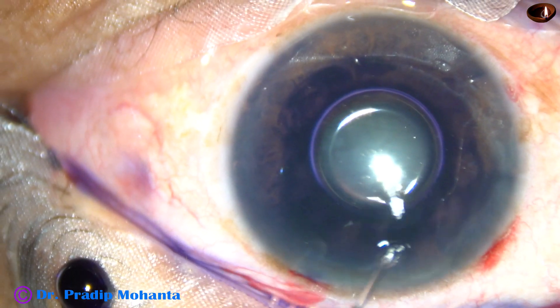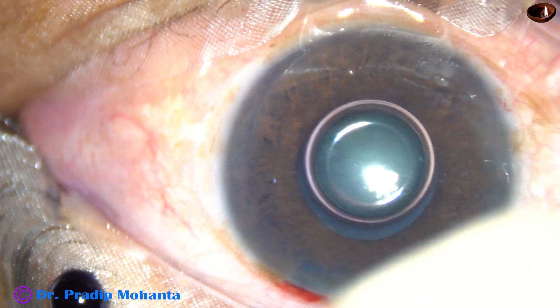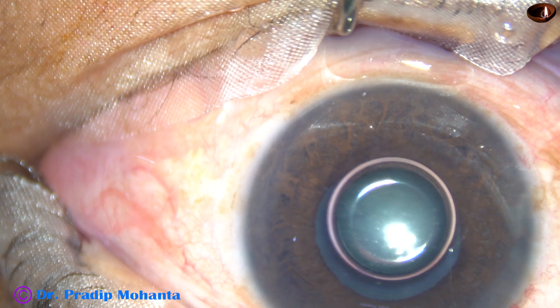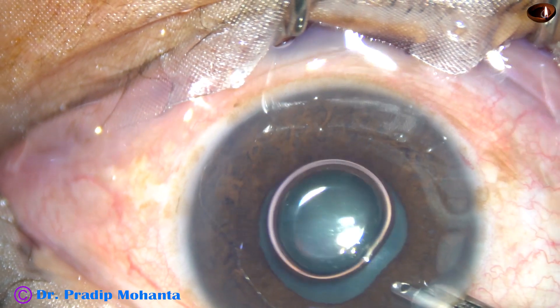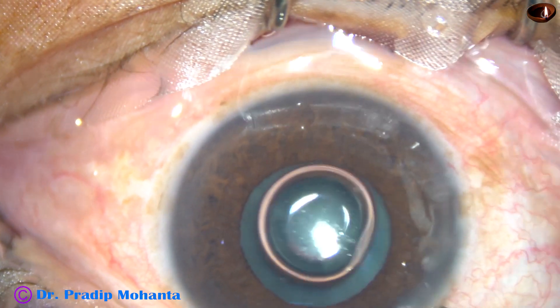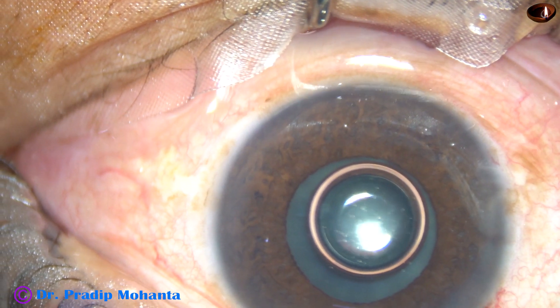And now I am going to inject a bit of adrenalin to see if the pupil dilates a little more. Yes, the pupil has dilated a bit. But this is not enough for comfortable surgery and I have decided to use a pupil expansion device in this case.